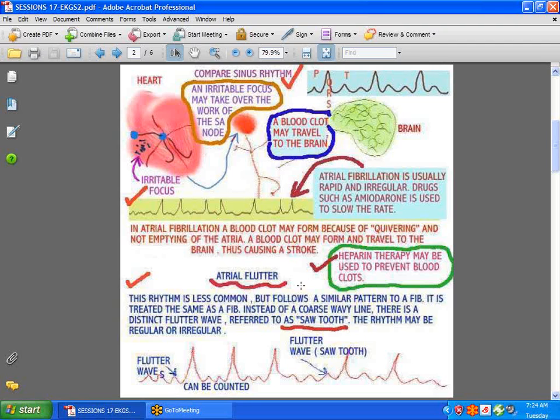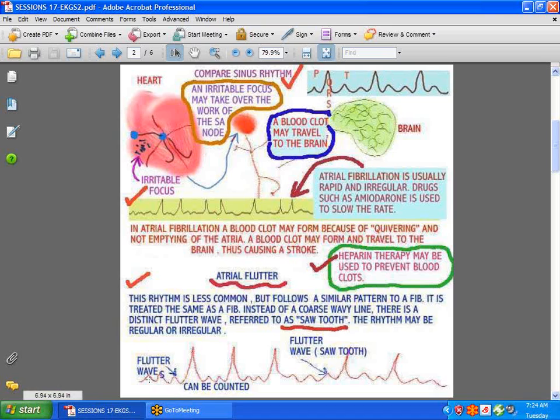We also have atrial flutter, which is less common but follows the same pattern as atrial fibrillation. There is a very clear sawtooth configuration on the baseline of the EKG. You have what are called flutter waves — you can count them: one, two, three, then a QRS, then more flutter waves — very distinct sawtooth flutter waves. The treatment is pretty much the same.